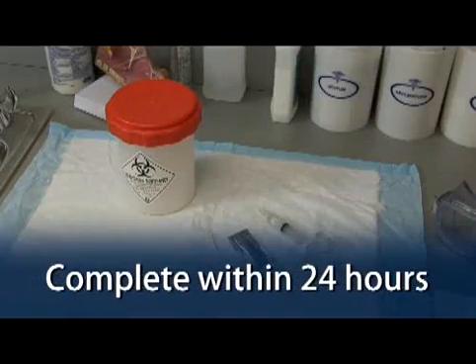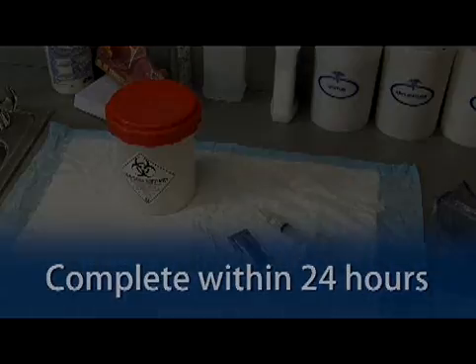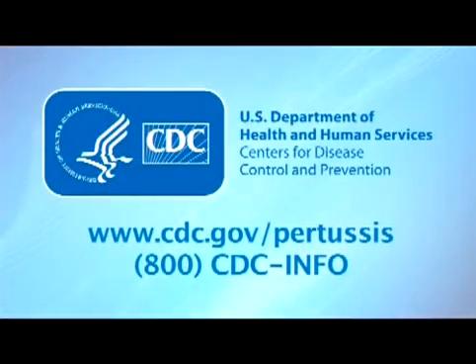Plating for culture will need to be completed within 24 hours of specimen collection, so timely transportation to the laboratory is essential. A message from the U.S. Department of Health and Human Services and the Centers for Disease Control and Prevention, CDC.